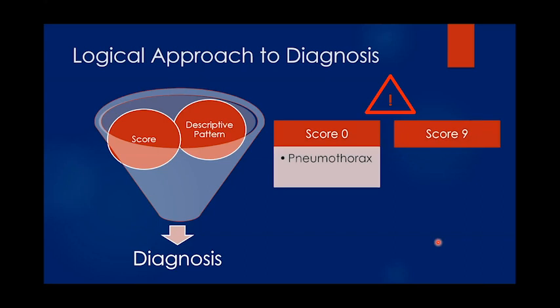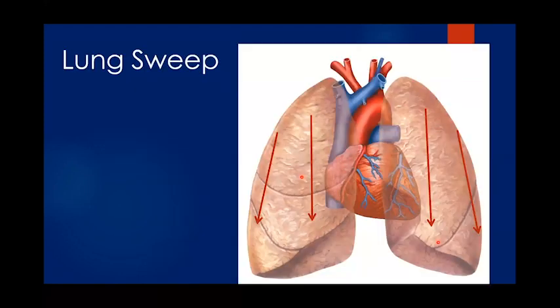And at the same time, you can score the lungs and have a score of 9 and above, which we know in RDS means that this patient might benefit from surfactant, but the diagnosis is actually TTN based on the description of what we have. So my message is that scoring is not enough. We have to describe the pathology.